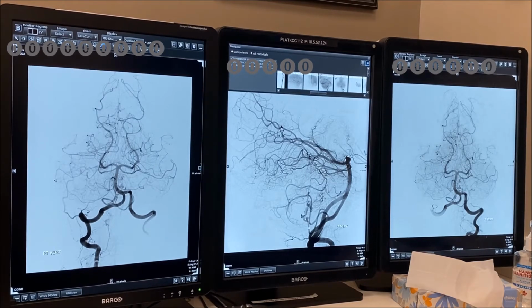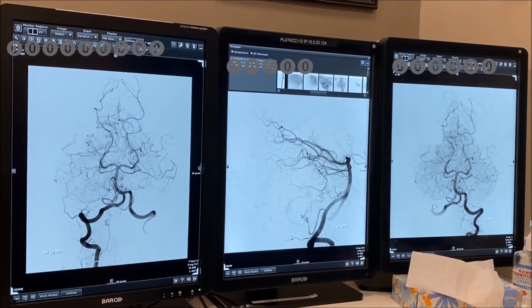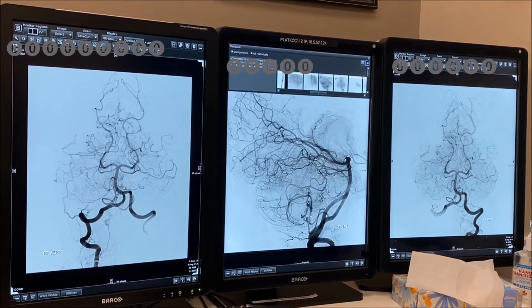So it's important where it goes. This is the tonsil, the tonsillar segment, the choroid point, right? Now we need to understand exactly where that is. But it's relatively proximal. And you see how there is more than one vessel, right? There's more than one channel, let's put it that way. And it goes all the way there. What could you do to try to work this thing up better?